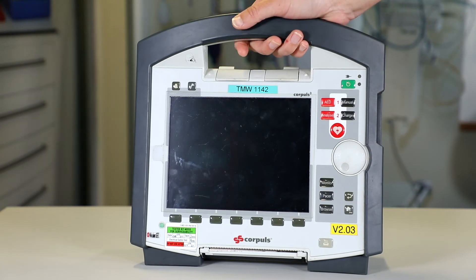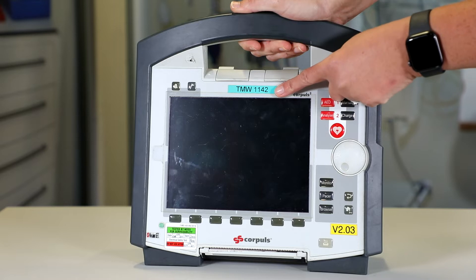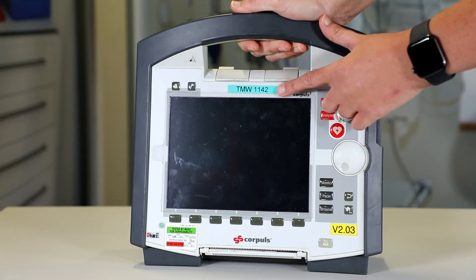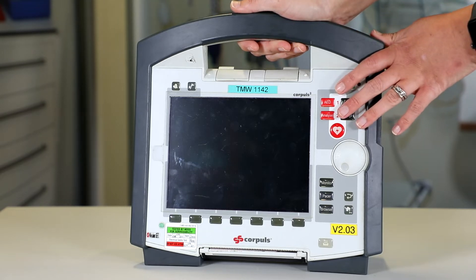Once I'm happy that that's fine, I'm then going to have a look at the TMW asset number, which is this number here. I'm also going to check that this number is matching to my other component parts — so on my defib and also on my patient box.